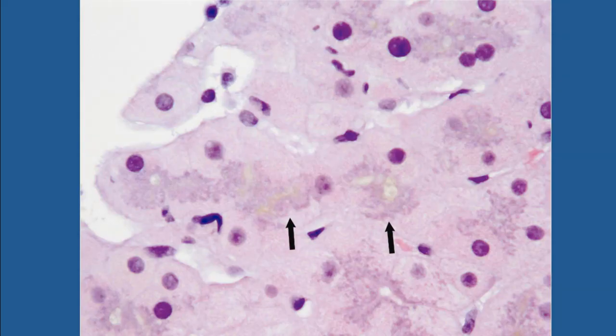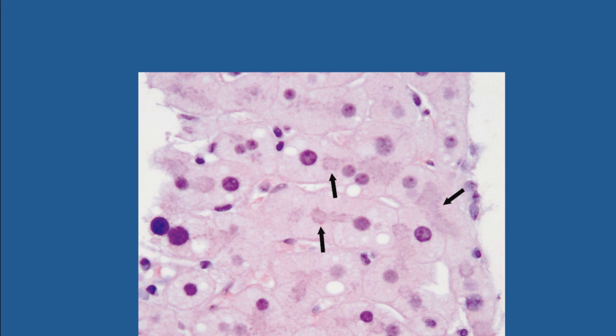Now, sometimes on the H&E, you can actually see everything that I was showing you on the immuno or on the graphics on the H&E stain. And here, for example, you see the bile canalicular network. And this dark purple thing here, these are the tight junctions. So you see the bile canalicular network. And in this particular instance, there is cholestasis. So there is actually bile within these bile canaliculi. And sometimes if the conditions are just right, the staining is right, the metabolic state of the hepatocytes is just so, you might actually see these bile canaliculi even on a H&E stain.